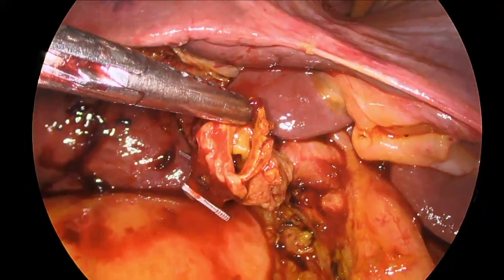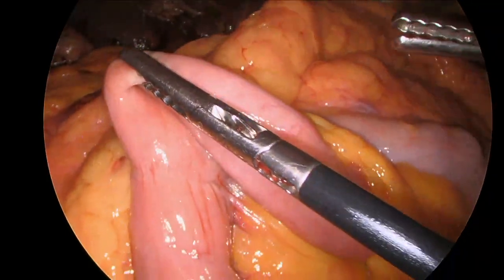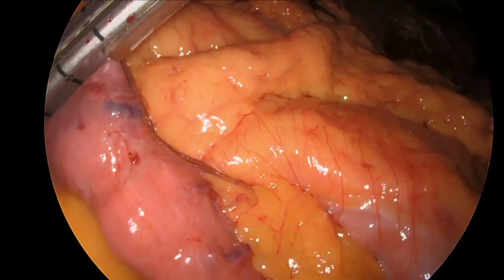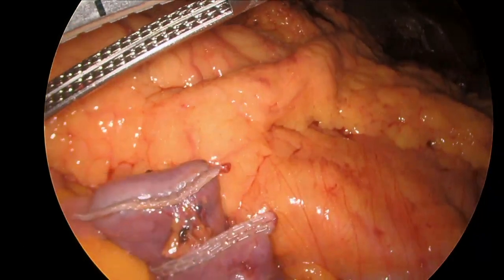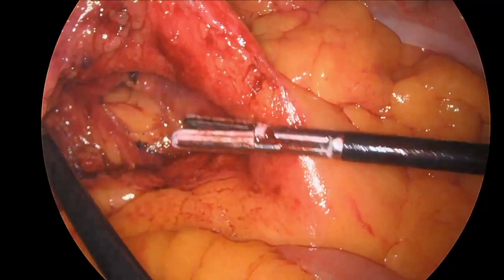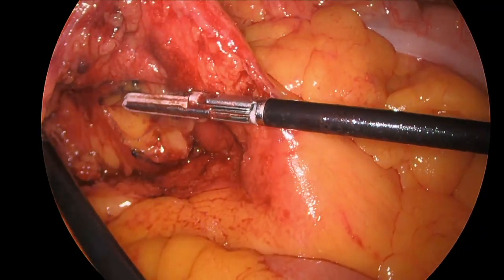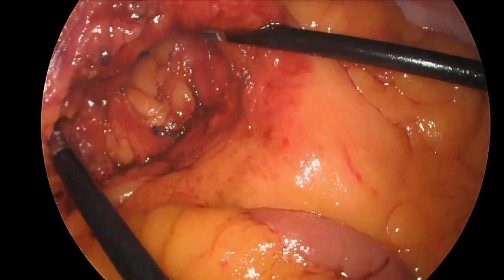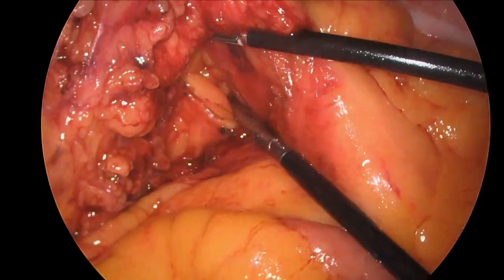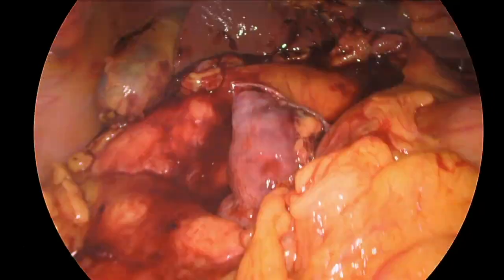Because of the long extra hepatic duct as well, this is an opportunity for intracorporeal repair. We suitably select a limb of bowel for the Roux-en-Y and create a window in the transverse mesocolon. This allows us to prepare a retrocolic Roux limb.